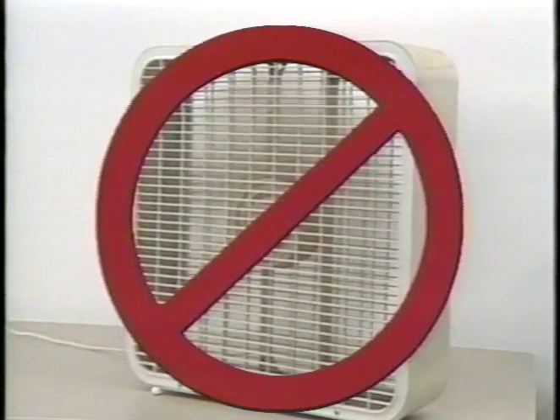Ventilation in this area should be controlled. Fans should not be used since they cause dispersion of possible pathogenic particulate matter into the area, increasing the concern for workers' safety and providing a continued medium for bacterial growth on work and device surfaces.